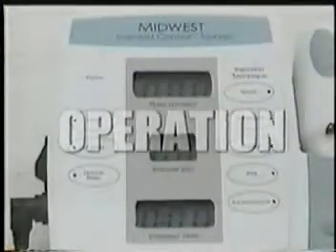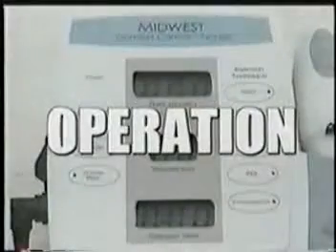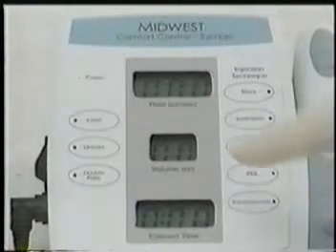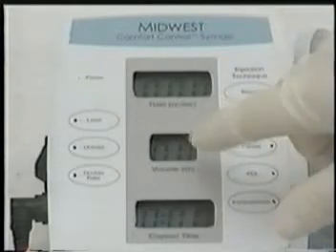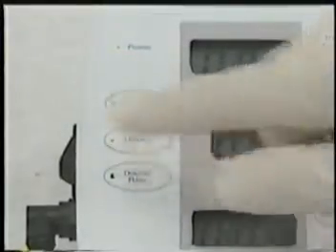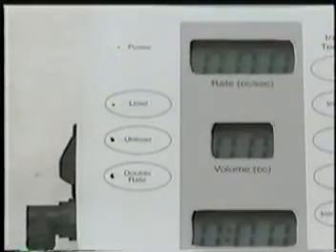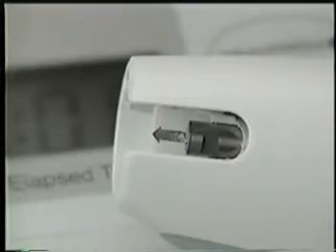Let's walk through the controls and the displays which are on the unit as well as the controls on the handpiece. First, the unit. When the CCS is switched on, the power light on the face of the unit will be lit. Beneath the power light are three buttons: load, unload, and double rate. Pressing the unload button retracts the harpoon in the handpiece. Pressing the load button once will advance the plunger and embed the harpoon into the anesthetic cartridge.